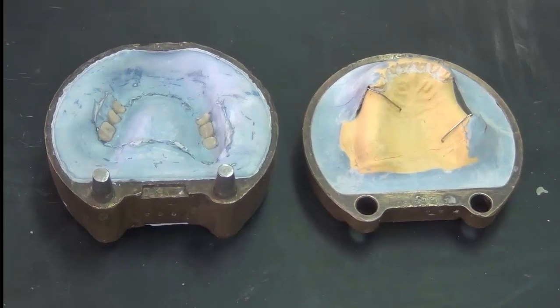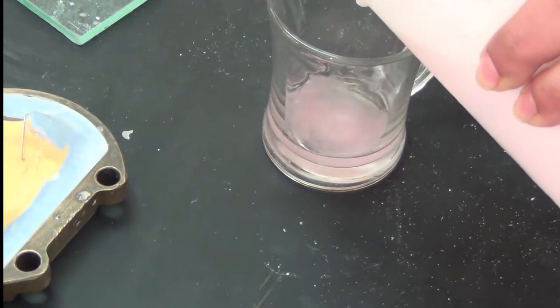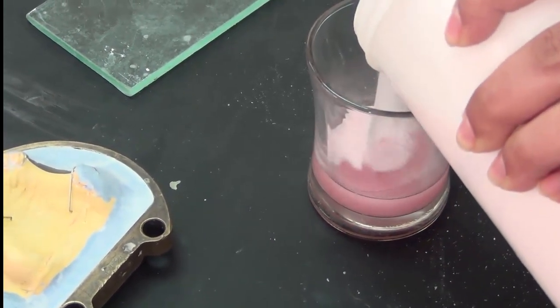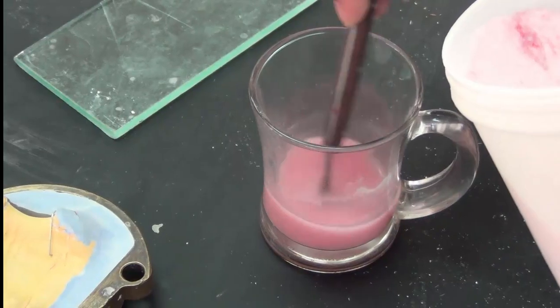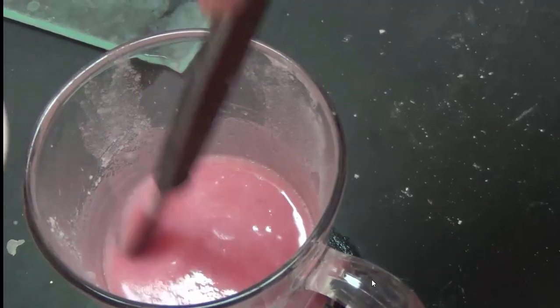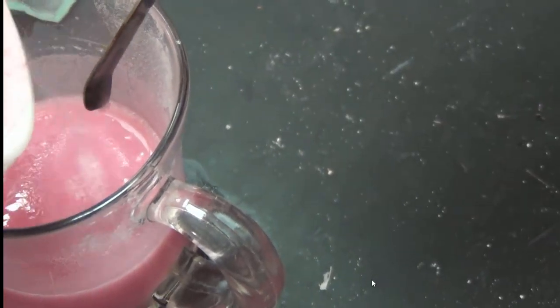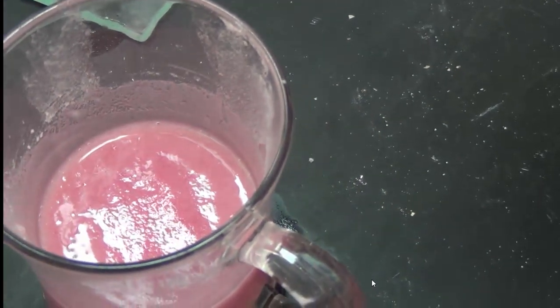Now we're ready to do the acrylic packing. So we have the monomer ready. We add in the powder according to the manufacturer recommendation in terms of amount. But in general, we keep adding powder until it no longer mixes, you no longer see the powder unsoaked. So if we look closely at the powder, when we are close, we keep adding bit by bit. See this last bit I added, it soaked itself, so it took the monomer. I keep adding in small bits to the surface, it soaked itself. When I find that the powder no longer soaks itself, it's slowly soaking, that means it's sufficient.